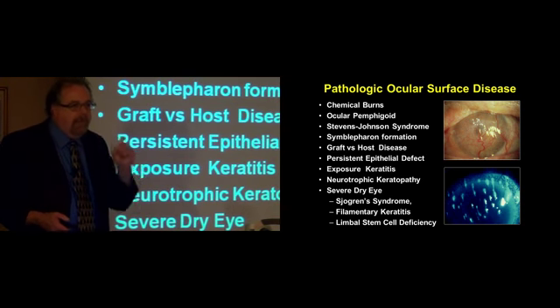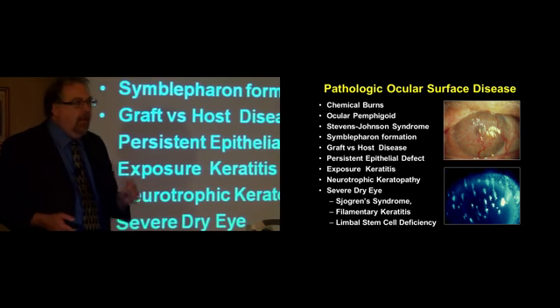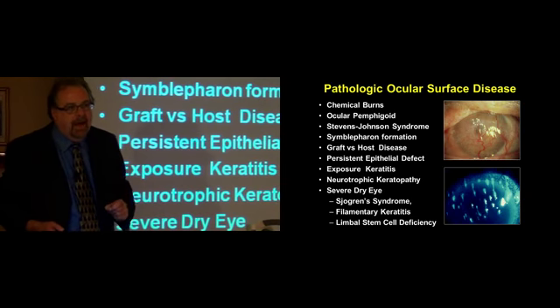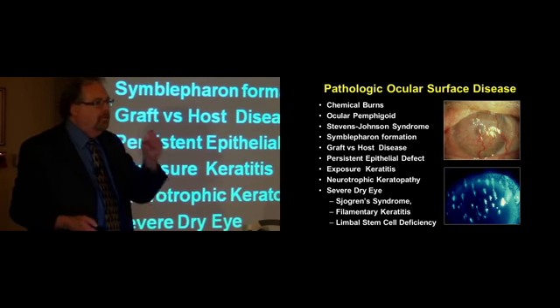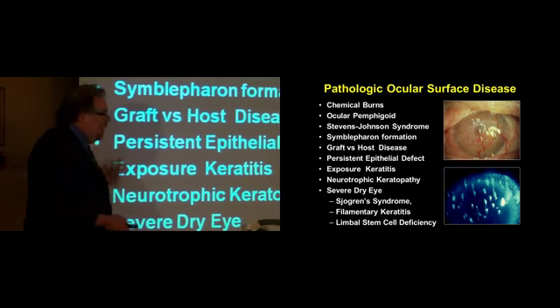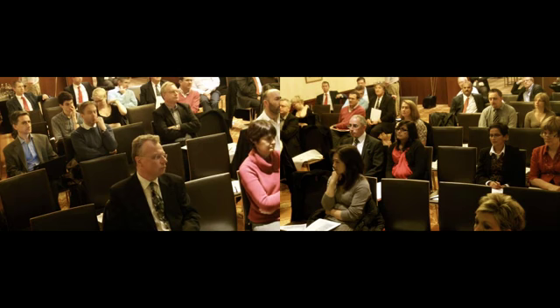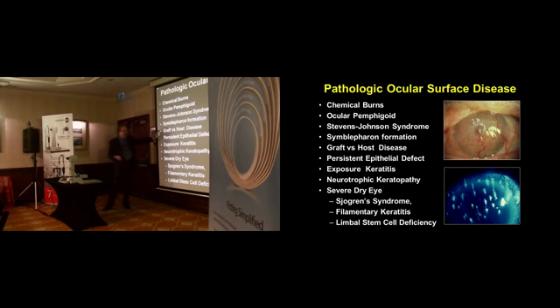There is no medical treatment we know of today that can surpass what a scleral lens can do therapeutically for the eye. These lenses become the single primary treatment for managing these kinds of underlying pathologies. So these are really patients that we want to target with these modalities because these contact lenses will be a life-changing experience for those individuals.